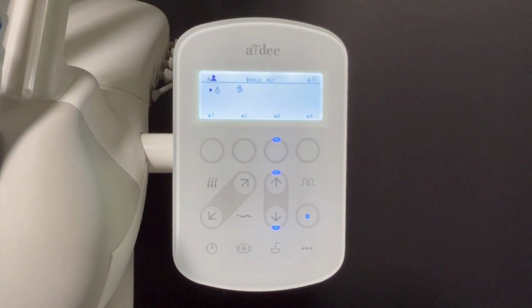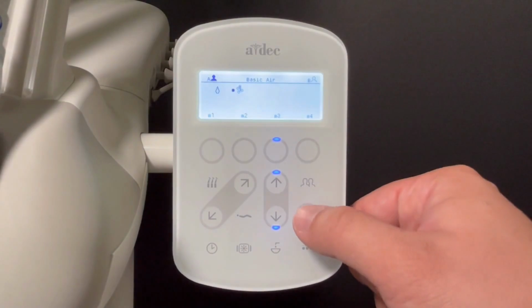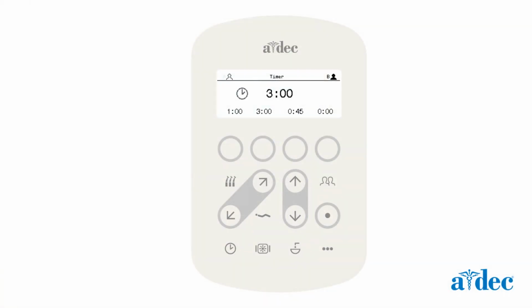Notice how the dot moves to show the highlighted function when the Adjustment button is pressed. For non-handpiece modes, such as timers and flush, the behavior is slightly different. Pressing the Adjustment button enters the Adjustment function, where a user can make a change using the chair base up or down arrows. This is followed by a touch and hold of a soft key to save the new value. The user can then press the Adjustment button again to exit.